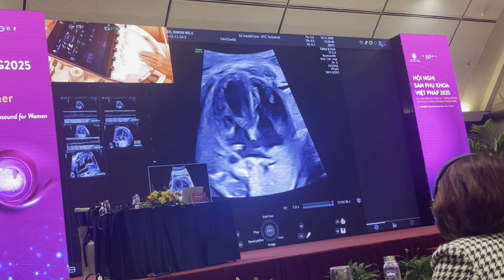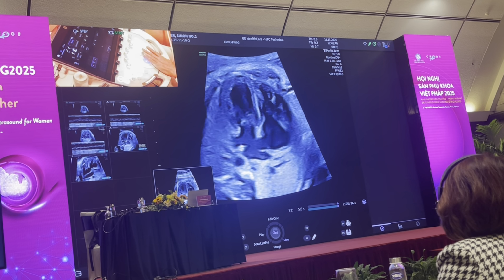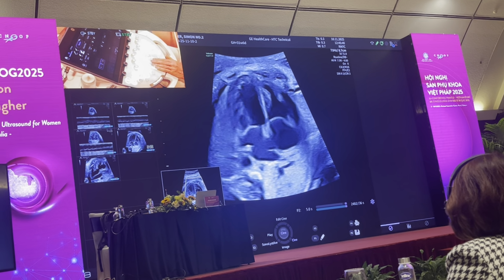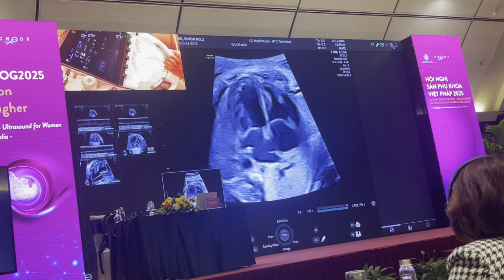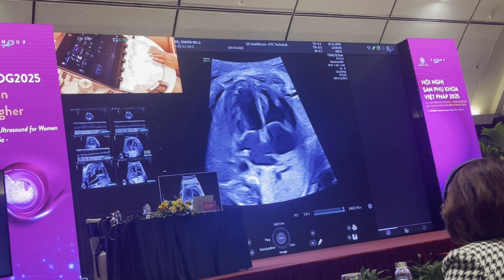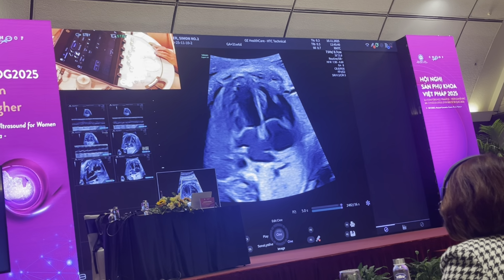So again, I can see the baby. I just wanted to get a long skinny loop, just demonstrating the cardiac rhythm. And I can see that the baby goes intermittently in and out of the rhythm disturbance. Mostly the baby has got an irregular, abnormal rhythm, and then has an intermittent episode of normal rhythm. As I say, these babies carry a better prognosis if it's intermittent.